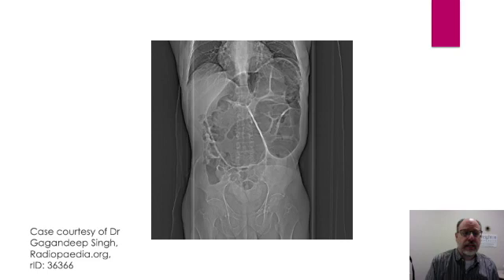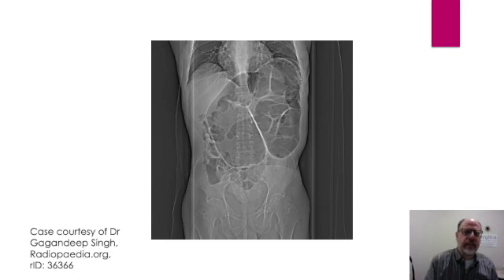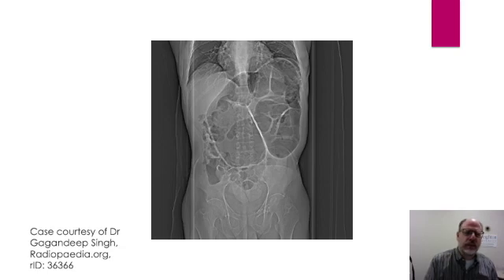This is another AP abdominal radiograph from the emergency room with a patient with abdominal pain. In this case, you can see a large dilated loop of bowel in the upper abdomen. Again, this has an inverted U shape with the lower portions of the bowel arising from the pelvis, suggesting this may represent sigmoid colon. This is what is termed the northern exposure sign, with loops of sigmoid colon extending above the expected location of the transverse colon and lying just below the diaphragm.